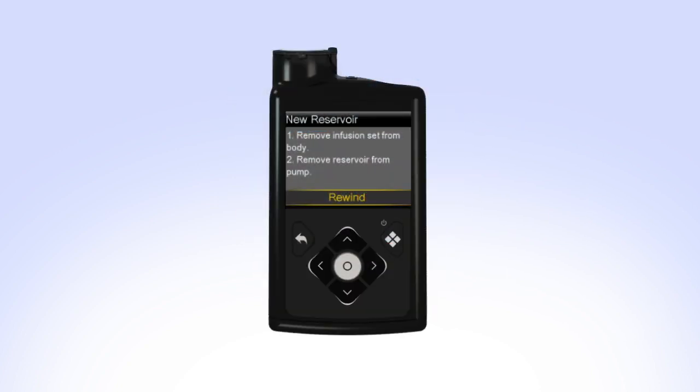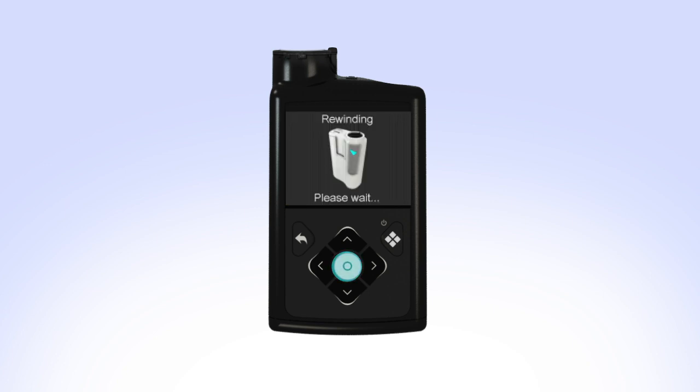On your pump, select Rewind. The rewinding screen will appear while the piston rewinds. Rewind complete appears when the piston has rewound.